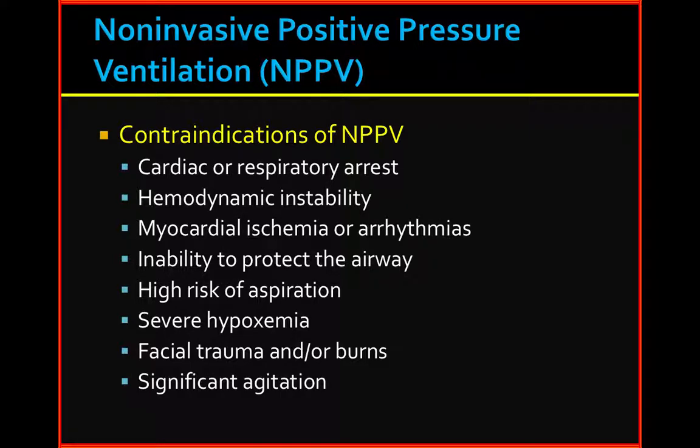AC. The other way we call it is assist control. The other name for it also is continuous mandatory ventilation, or CMV. Now this is the most common mode of ventilation that you'll see, especially on a medicine floor or medicine unit.